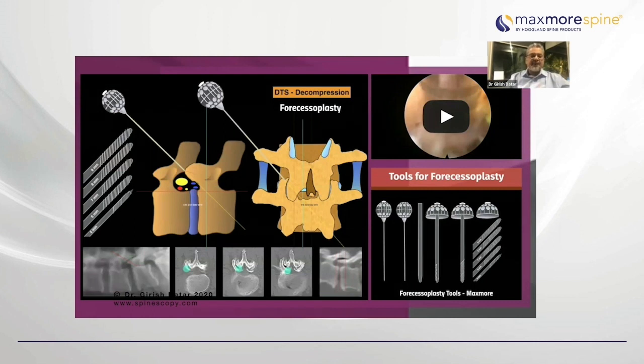That means you are not only dealing with the tip of the superior articular process, we are also dealing with the base, that is the overhanging part of the superior articular process, till you reach the caudal pedicle. So this is going to be the kind of trajectory that you are getting inside. It is going to be from cranial to caudal, from lateral to medial, till you reach the paracentral region.